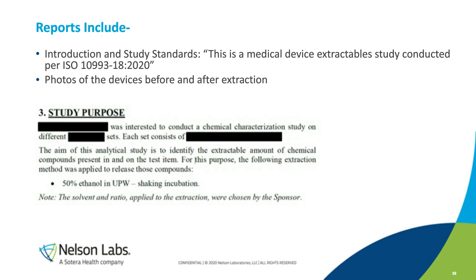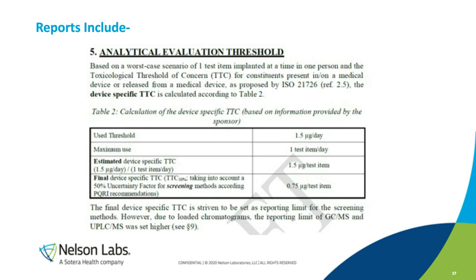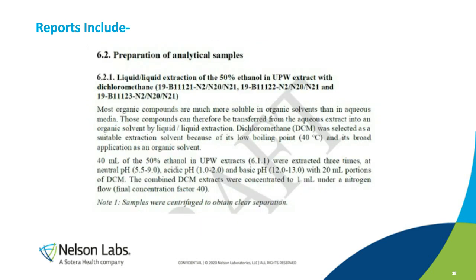So the study purpose, I think, should be there for sure. You have to have this analytical evaluation threshold articulated in the report. Make sure that that's shown explicitly. Otherwise, you're going to get a question no matter what.